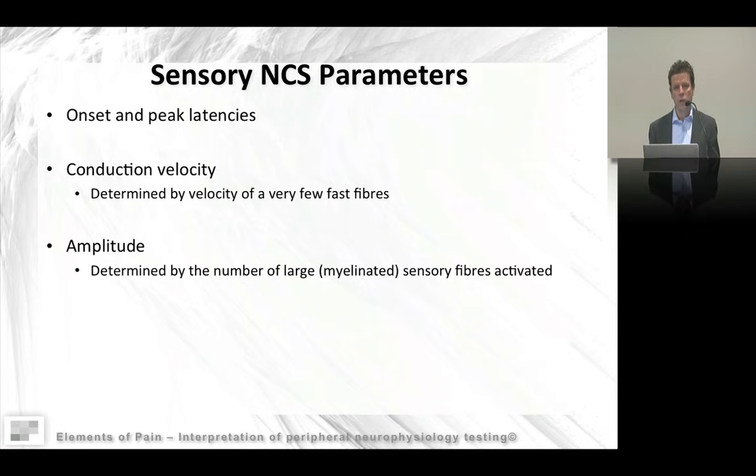The important thing about sensory responses is that there's a lot more technical factors. The responses are in microvolts rather than millivolts for the motor studies. As a result, technical factors, poor skin preparation, electrical interference around the room, and other factors can interact with it quite greatly. So it does make it a more difficult part of the test to do, and thus a more difficult part of the test to interpret.